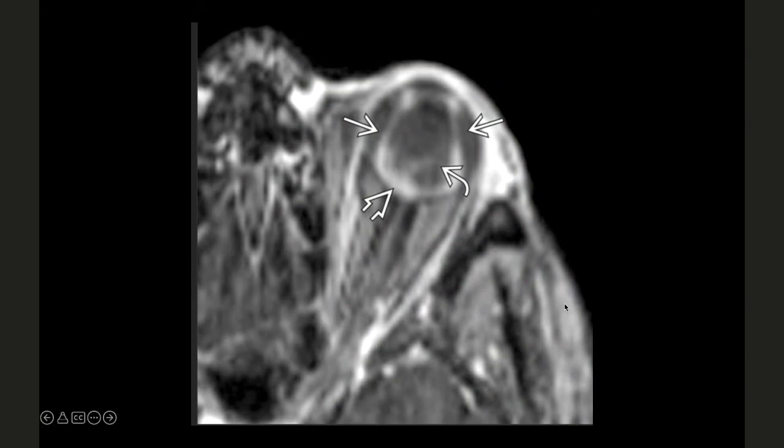This one is going to be my post-contrast sequence because I see all this enhancement going on in the brain. And I'm going to tell you it's post-contrast too. You know, all these structures are enhancing. So this tells me it's a post-contrast sequence. So this one is going to be endophthalmitis because I'm talking only about the globe. For all the stuff that's going on behind the eye, I probably need a little bit more. Maybe is there an optic nerve, a little bit of extra enhancement? Are the muscles, which tend to enhance normally, like I showed you earlier, thicker? If they're thicker, then is it some myositis also involving portions of the muscle? But when I'm talking endophthalmitis, I'm thinking only globe, okay?